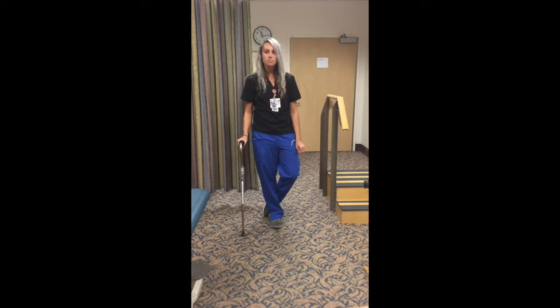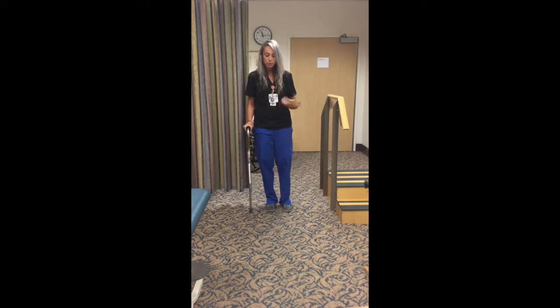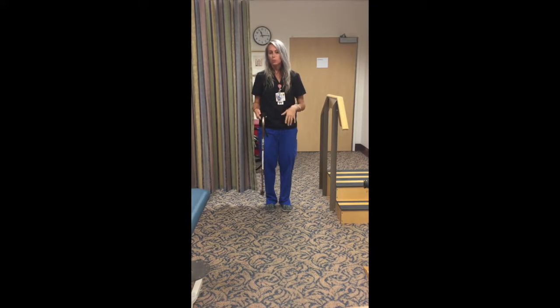Can you go through that and then go to stage two again? Mm-hmm. So when you're just working on the mechanics of feeling comfortable in order to put all of your weight on your operated side, we break it down into simple 3-step walking. It's easier for you to get the hang of it first, and then after that you can start to go a little bit quicker and more normally.